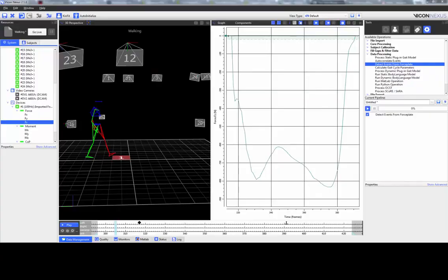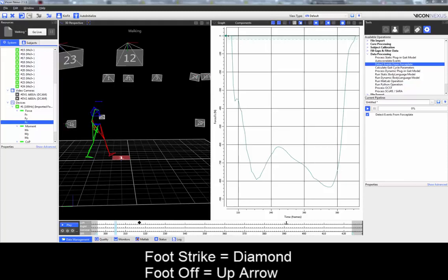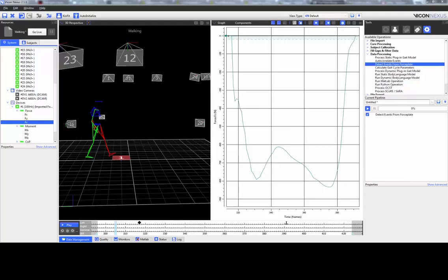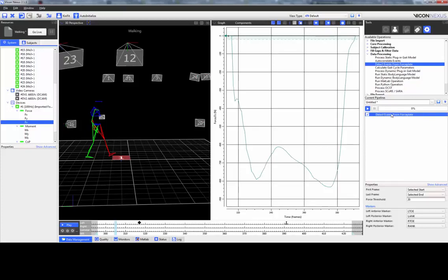The detect events from force plate pipeline operation automatically detects the foot strike and foot off events using the force threshold from the FZ channel and the markers that have been designated. You can adjust the force threshold and the left and right anterior and posterior markers.